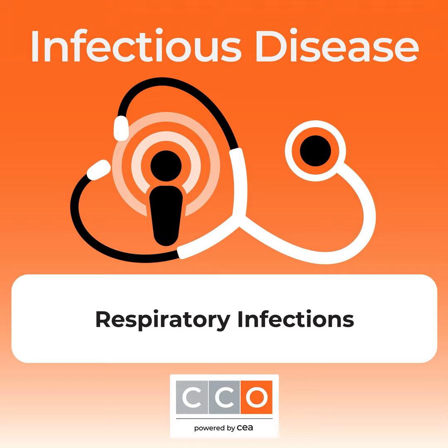Many of these molecular syndromic panels are done in laboratories. However, it's important to know that some of these panels are actually point of care tests. And by point of care, I mean that these are tests that can be run at the bedside to the patient. For example, they could be run at an urgent care center or within a doctor's office, as opposed to having to send the specimen to a true laboratory to run the test.